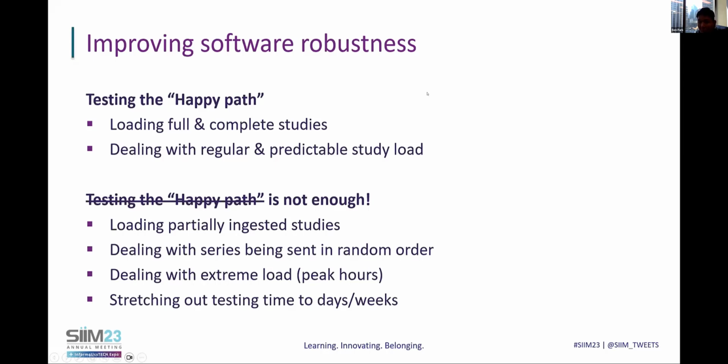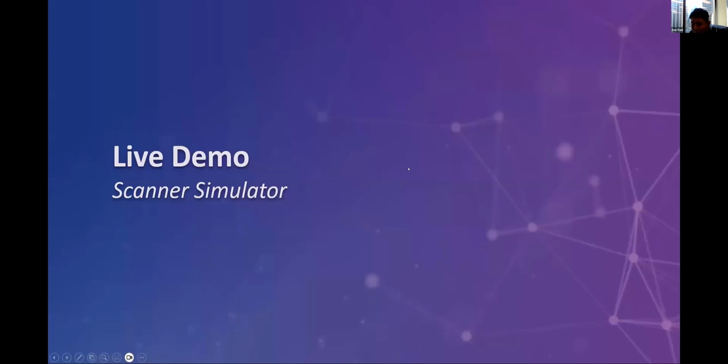We have to test not just the happy path but all the different scenarios that really happen in the actual environment. We need to load partially ingested studies as studies are coming in, the order can be different, and in peak hours there is extreme load. We also need to stretch these testing scenarios into days and even weeks. So in order to do this, I implemented a scanner simulator, and I'll show you a live demo of how it looks.